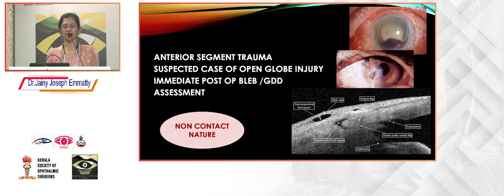But in patients with anterior segment trauma or a suspected case of open globe injury, the imaging modality of choice will be ASOCT. Immediate post-op bleb assessment is better with this non-contact technique of ASOCT. And the positioning of glaucoma drainage devices can be immediately assessed by ASOCT due to its non-contact nature.